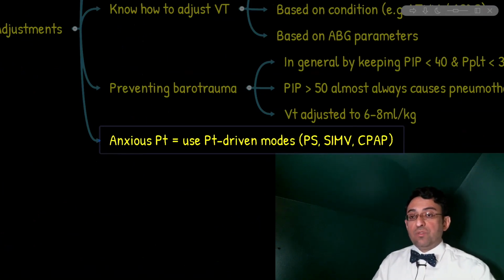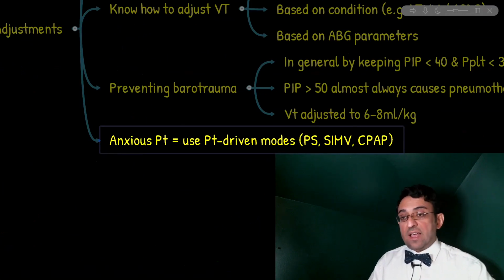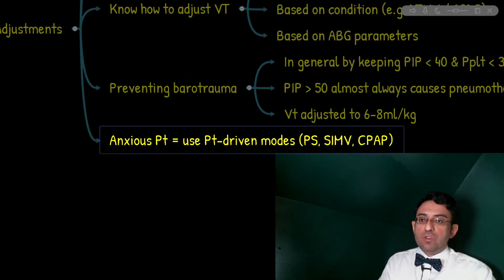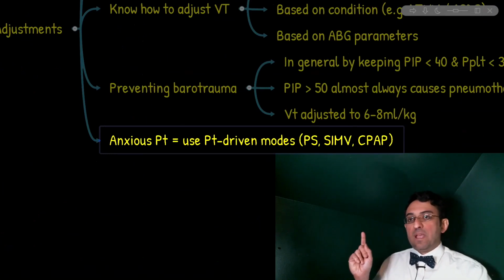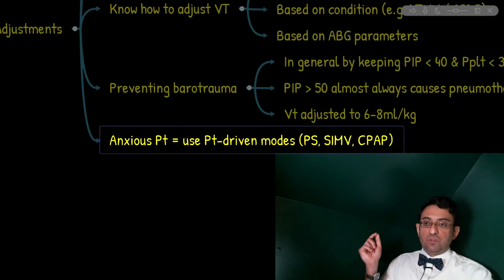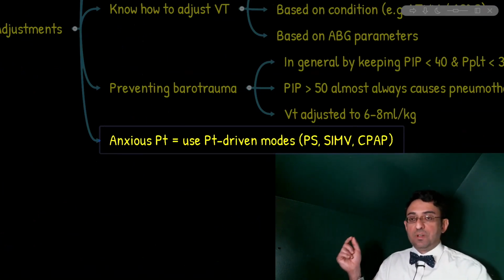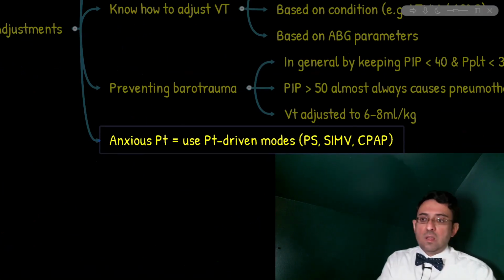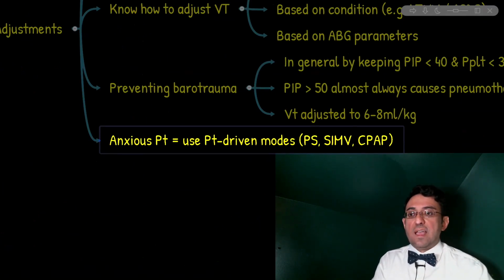An important question regarding hemodynamic status and adjustments for PEEP. What two groups of patients should not have high PEEP? One is the one that we already discussed, and those are patients with CO2 retention, because as we mentioned, PEEP, if it goes high, would collapse the alveolar capillaries and increase dead space, and also would impair ventilation. The second group of patients are those with low blood pressure or shock. Why is it so? Because it reduces venous return and further worsens the cardiac output.